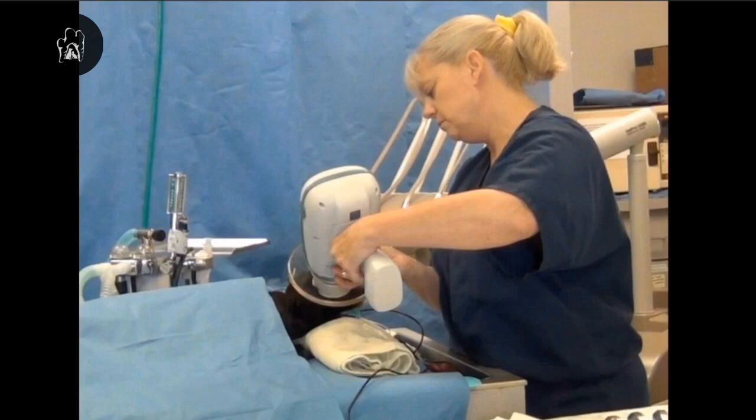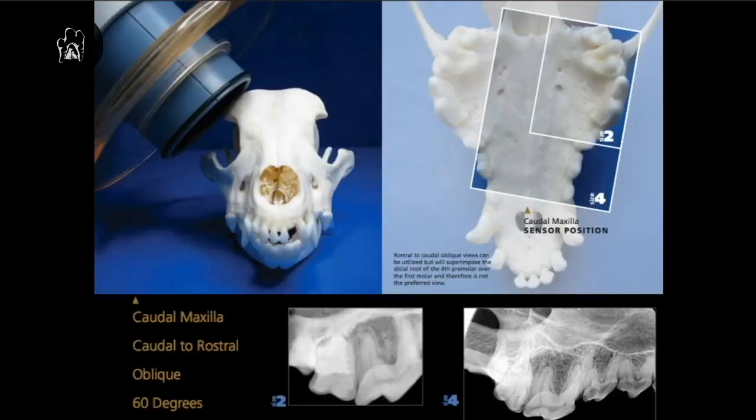The first thing we're going to do is standardize not only the positioning but also the sequence that we take these radiographs. We set up our template in our software so that it is numbered exactly as I'm going to take you through this sequence. We always start our full mouth series on the right maxilla, just like Annie's showing you right there. We're using a Nomad, which is a handheld, so Annie is using that 60-degree designation.